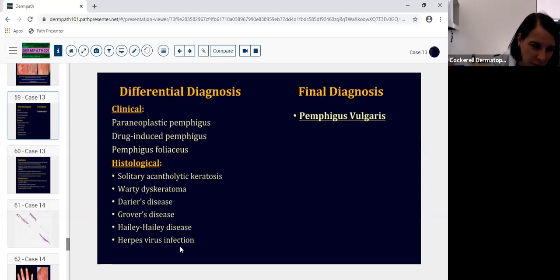Herpes virus infection, we talked about that. You're going to see those beautiful multinucleations. Hopefully, sometimes we don't, but you'll look in those follicles very, very hard, and you'll see margination of the chromatin, something to clue you in that this is herpes. I don't think we have a stain for that. Herpes virus would be nice, but at this lab, I don't think we have a stain. It can be tricky. Sometimes we just have to suggest it's herpes, or shingles rather, usually shingles on the skin. But we suggest it, so please understand why we don't have the beautiful features on every case.